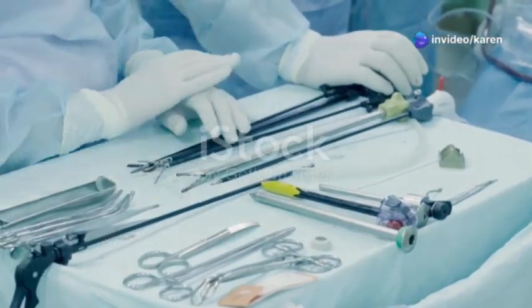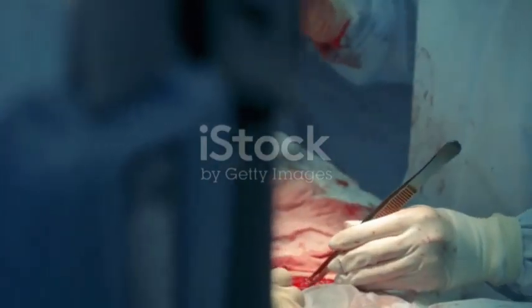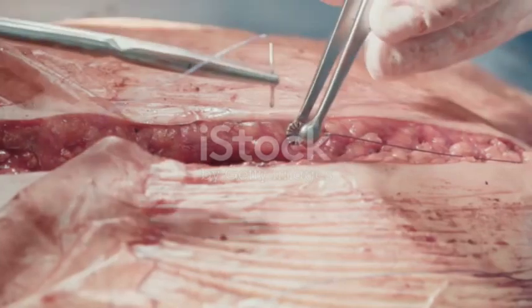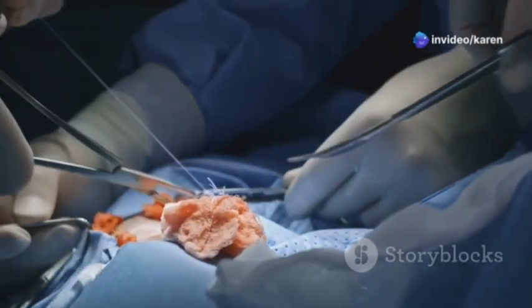Sutures and needles are essential tools in surgery. They are used to close wounds and incisions. This helps to promote healing and prevent infection. Sutures are strands of material used to stitch tissues together. Needles are used to guide the suture through the tissue.